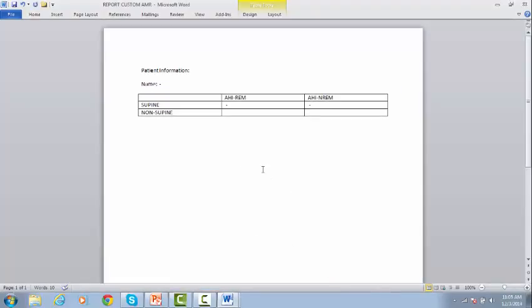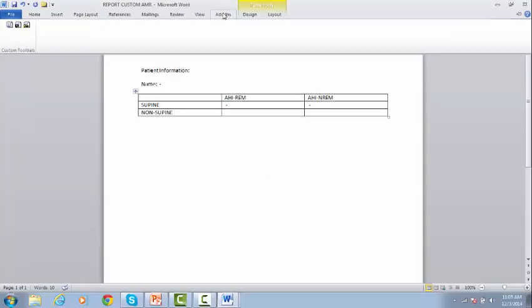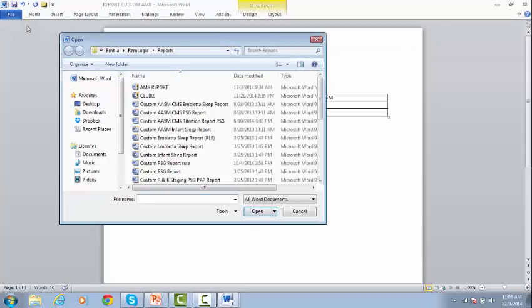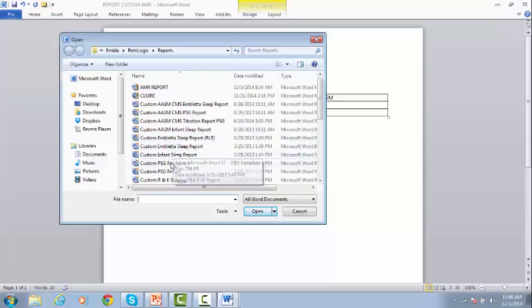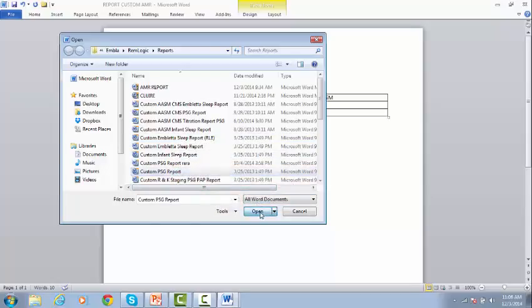If you want to edit the existing report templates, go to Add-ins, and from the Custom Toolbars menu, select the third option, which is to open the available templates. Click the report that you want to edit, and click Open.